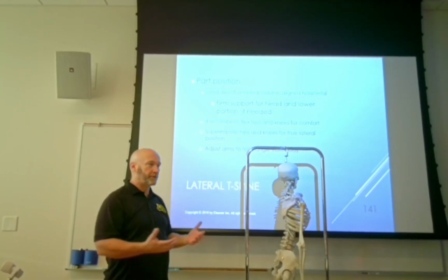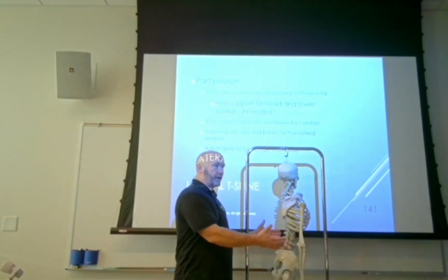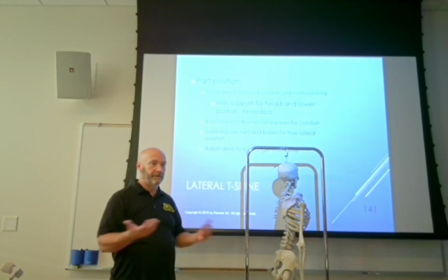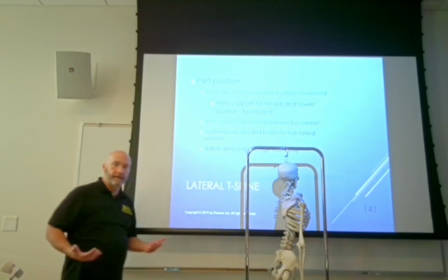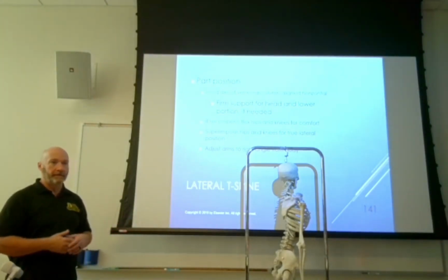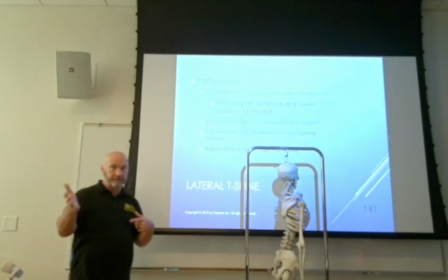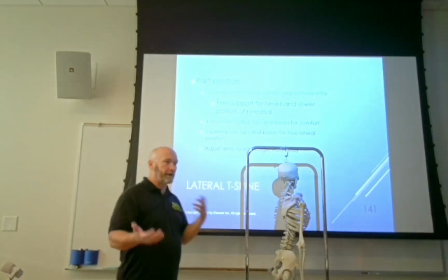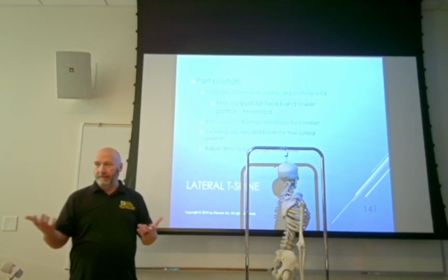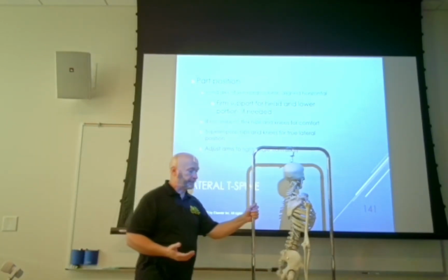So if you have a patient who has some features there, but they're not all that significant, even if it's a man, you may only need 5 to 10 degrees cephalic angulation. So take a step back and look at the patient's spine, and then angle your central ray accordingly. Does that make sense? But remember, that's for practical use. But remember, the test question is going to be 10 degrees cephalic for women, 15 degrees for men.